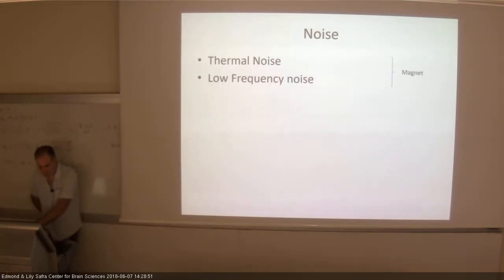We have some sources of noise that arrive from the magnet itself, so some thermal noise in conjunction with specific tissue. It's not a nice word to say about a subject, because usually it's humans, but you have some interaction between your body and your tissue and the magnet noise, which you cannot predict exactly.